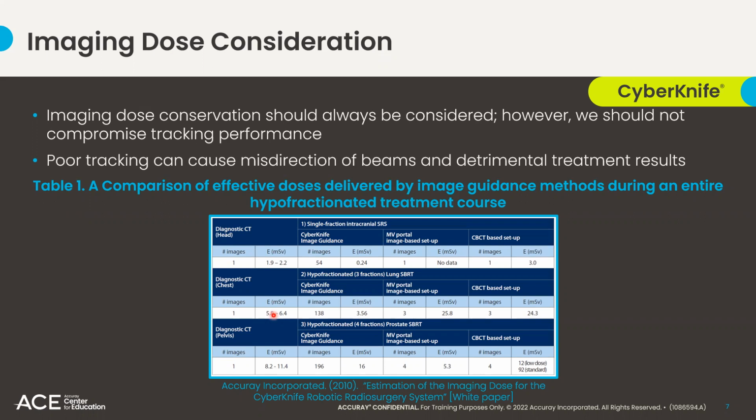findings of this study. The reason I'm showing you this is to alleviate any uneasiness you may have about setting appropriate X-ray technique. We all want to do what's best for our patients. And of course, we want to conserve dose when possible. However, since our algorithm relies so heavily on having a high contrast, high quality image, it is much more important to optimize our X-ray technique and ensure the algorithm parameter will perform as designed.